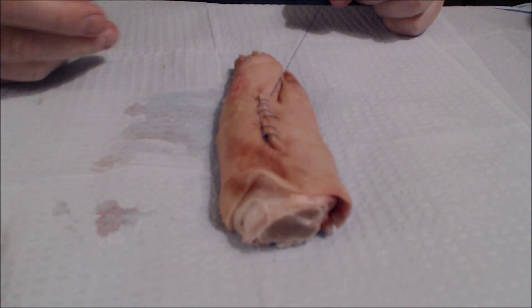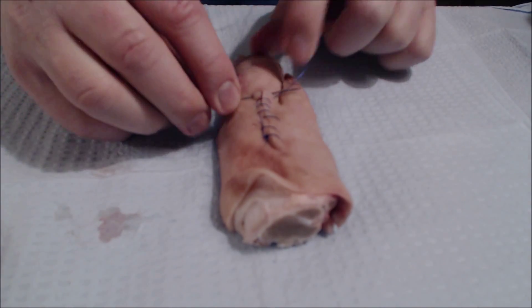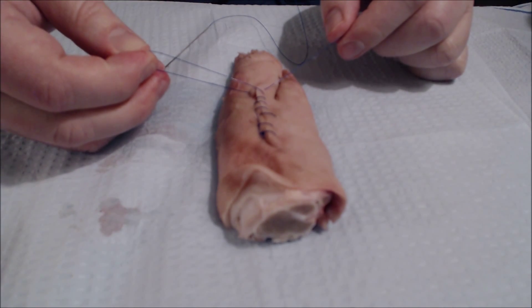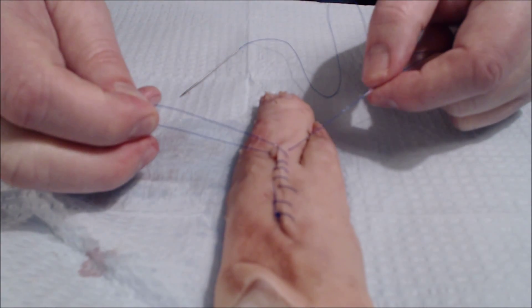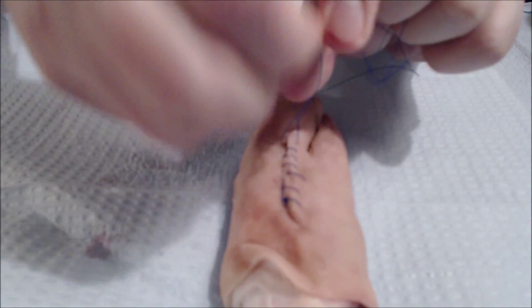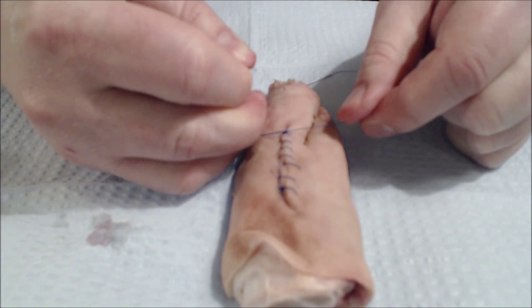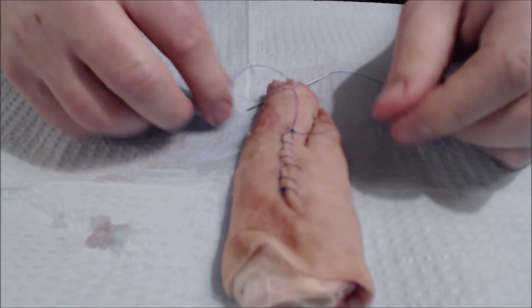We're getting toward the end of our incision here and we're going to have to tie it off. What we do is put in our last stitch — we don't pull it all the way through. You can see here that we now have two ends, and you tie these ends just like you tied the suture in the beginning.